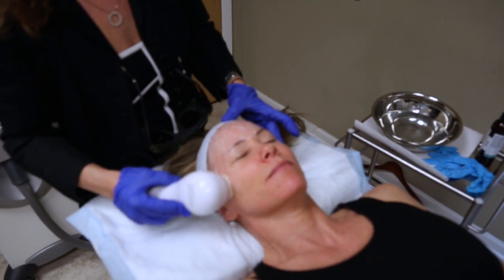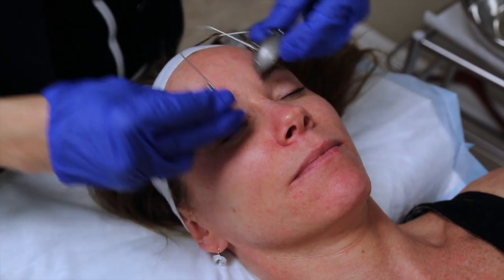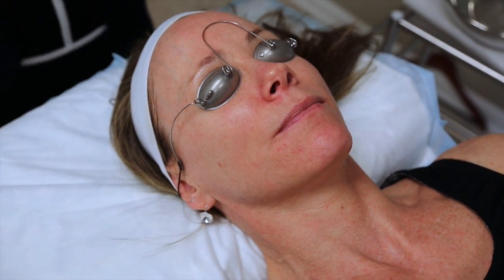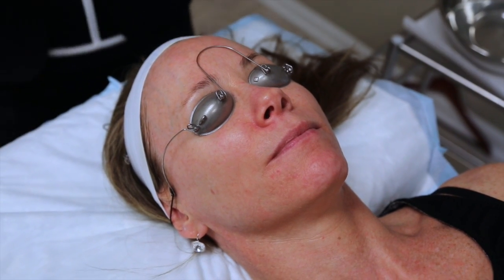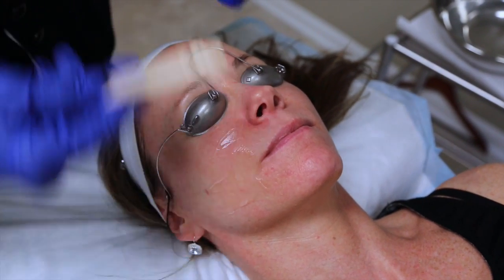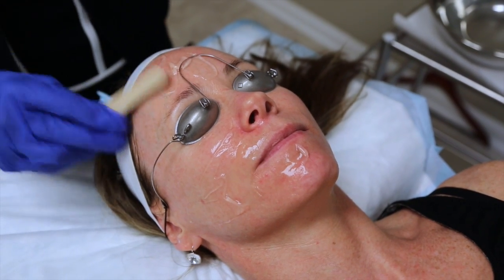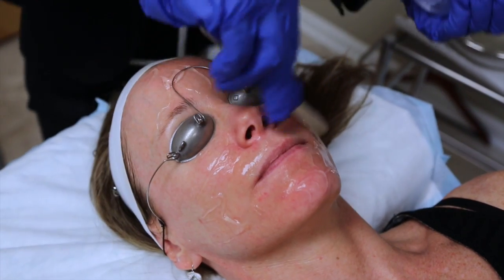Cleansing the skin. Okay, so we apply eye protection to the patient and the provider and anyone else in the room. Then apply aloe vera gel. This cools the skin and allows the handpiece to glide on the skin. And what we're doing today is a BBL, or a broadband light treatment.